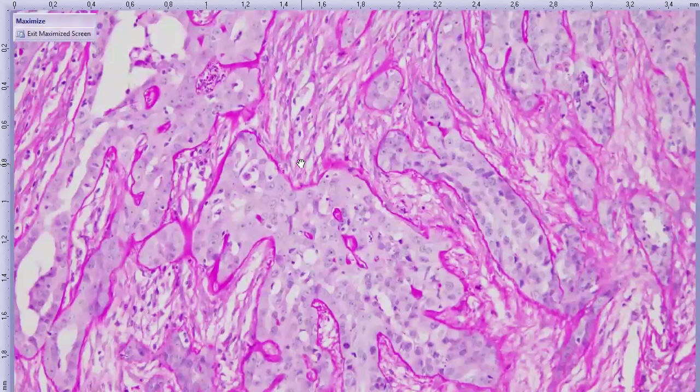Sometimes we do things on our dime. This is a very large slide. What did we offer? Let's see. Yeah, so the keratin and vimentin, and we discussed offering NSE, but NSE will probably stain everything here. The only reason we didn't go ahead and do it is because this is one of the large slides, and it's way more expensive to do it on that. So we were waiting to see if the owners would go for it.